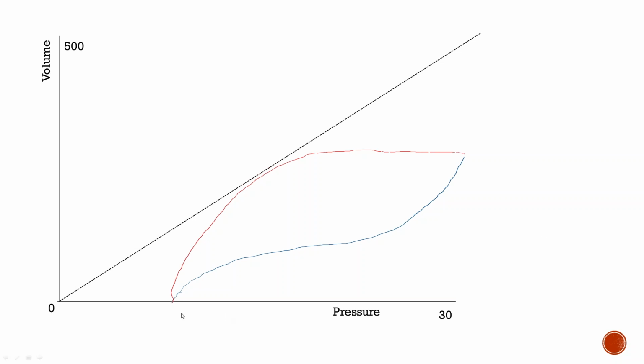So if you see, this requires quite a bit of pressure to get a change in volume, right? So when you're talking about changes in pressure and changes in volume, what are we talking about? Like compliance? Yeah, compliance, right? Perfect. So there's decreased compliance in the circuit because, as we all know, the compliance equation is volume over pressure. For a large amount of pressure change, you're getting a little amount of volume change, so you have very low compliance. So this is a low compliance circuit like ARDS, like the ones that we're most usually managing in the medical ICUs.